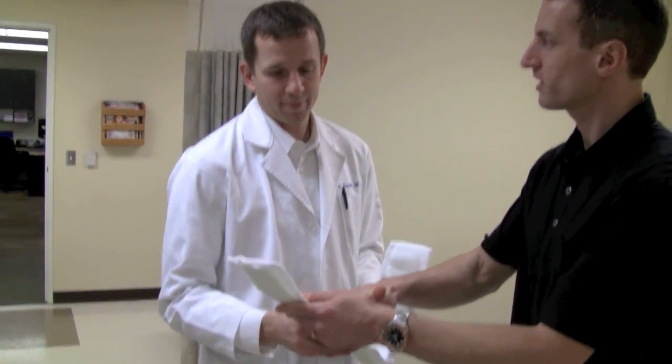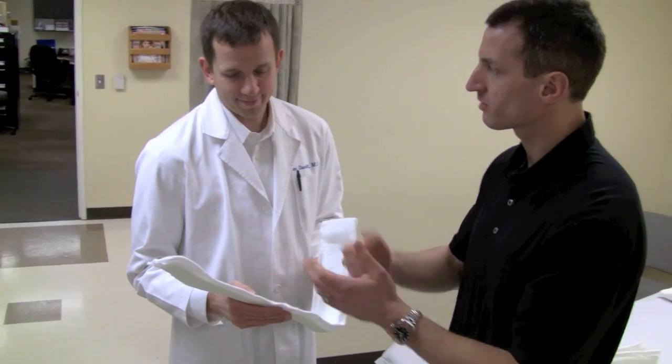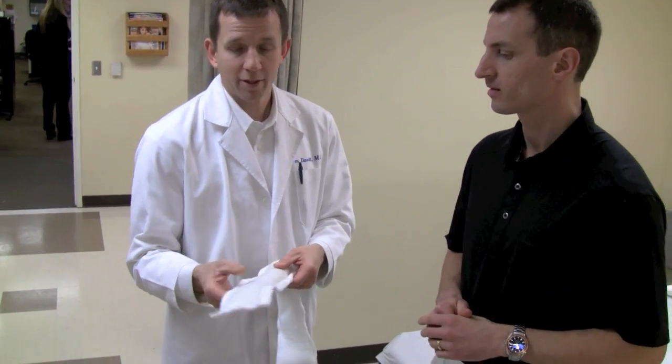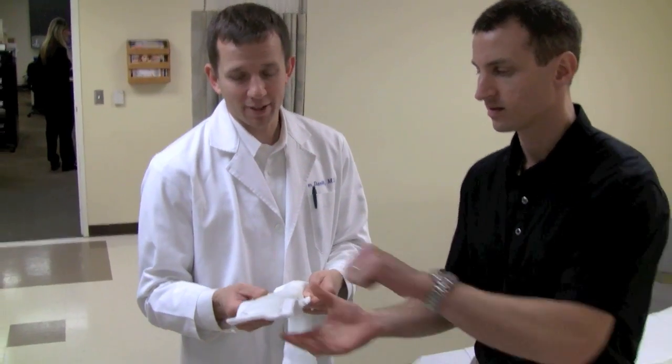This is Jim Davitt. He is a foot and ankle specialist at the Orthopedic and Fracture Clinic and has come by to share a couple of tips and pearls about the posterior lower leg splint. The first thing we were talking about was the correct side to face the skin. Do you sometimes see a reversal of that? Sometimes the splints come in with the hard side against the skin, which is obviously less comfortable.